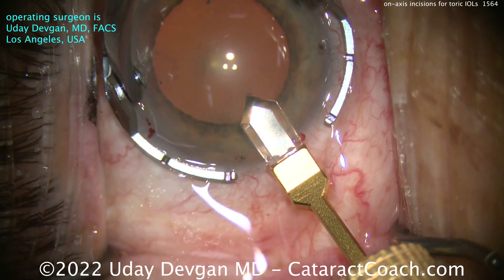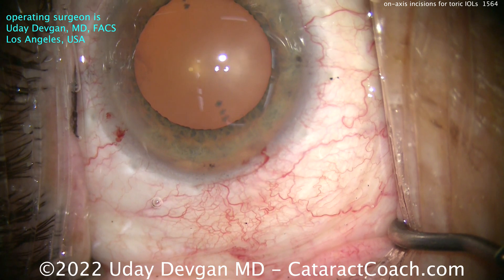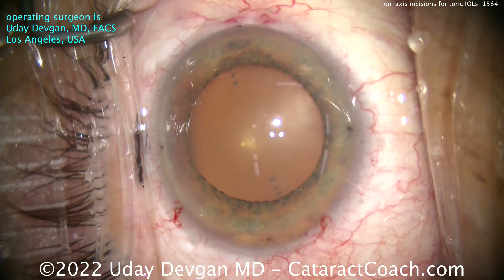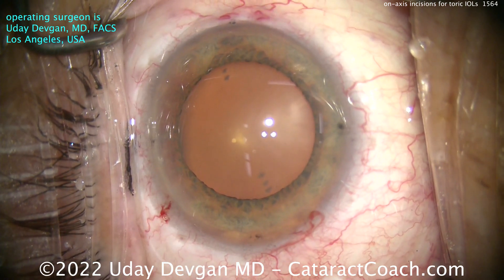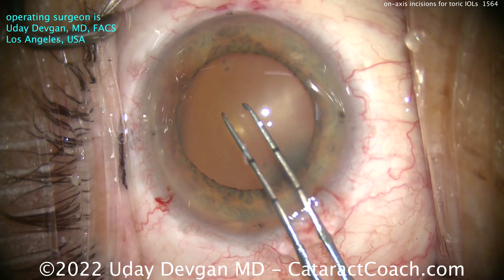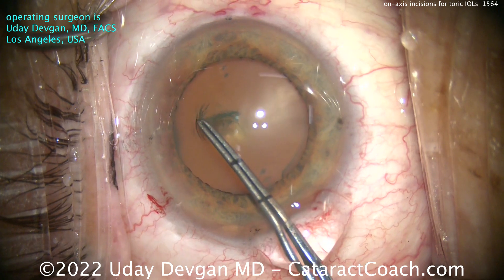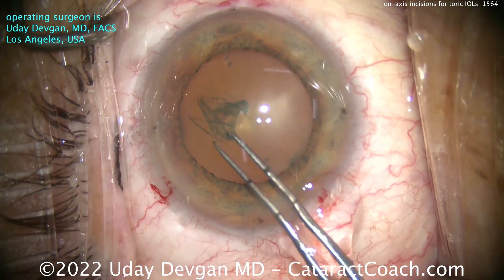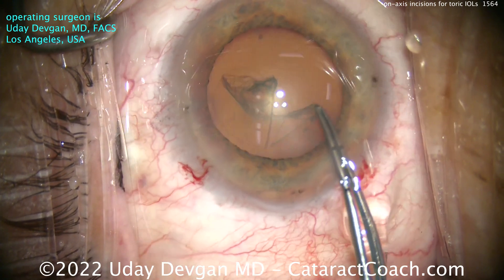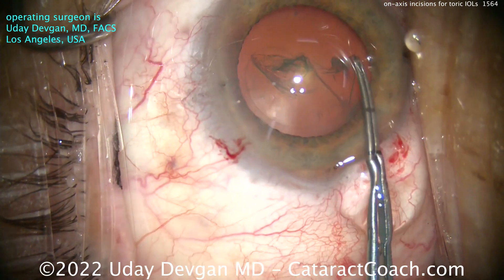I'm using a very thin keratome, so I'll slightly enlarge that. Why are you making the incision there? Does it even make a difference? Well, remember — astigmatism is a vector. Vector math, right? That means it has magnitude, like one or two diopters, and direction, such as steep at 20 degrees — maybe that's this case.